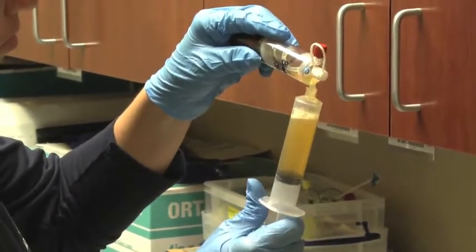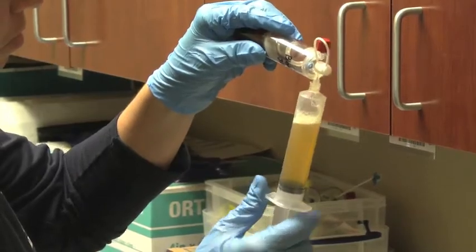Here we're removing the serum so that we can isolate the PRP. Now you can see in the tube our platelet-rich plasma.